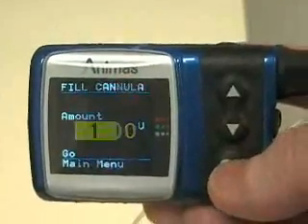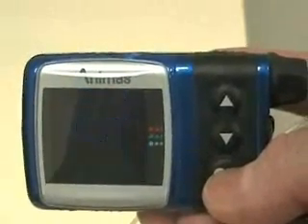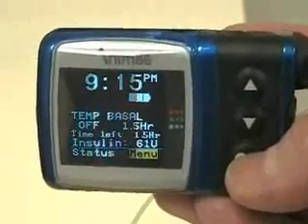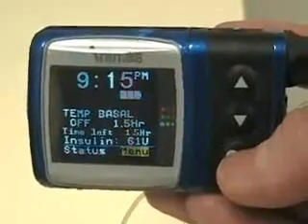Now I can say I want one unit of insulin, so I scroll up to a unit and press OK. The Animas 2020 delivers the insulin pretty quickly, and now I've received that entire one and a half hours' worth of basal insulin in the space of a few seconds.